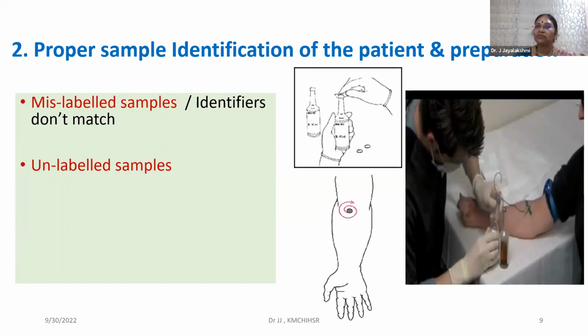Of course, sometimes the sample comes alone without the test request form. Certain labs process it, and sometimes certain labs would keep it there till the request comes. Now, what happens is that it would be a urine sample and you have left it out for long hours, and the organisms would multiply exponentially. By the time you get your test request sorted out and bring the sample back to processing, a few microorganisms have now become significant bacteria in your report.